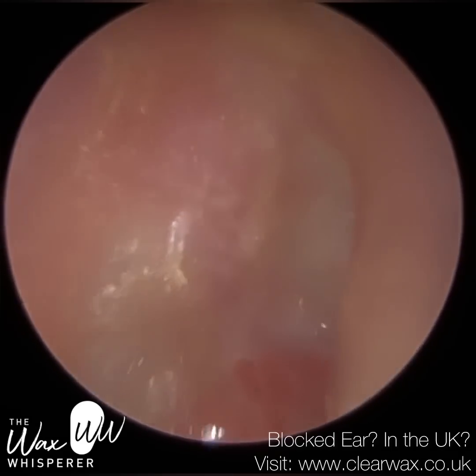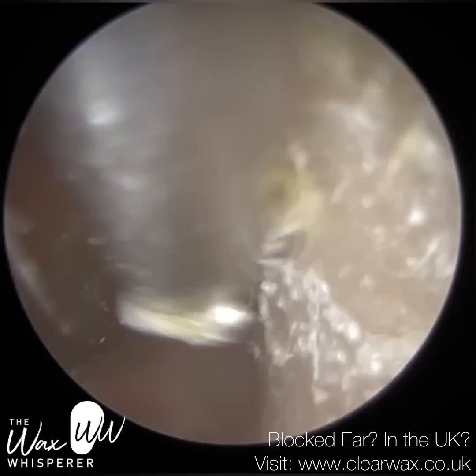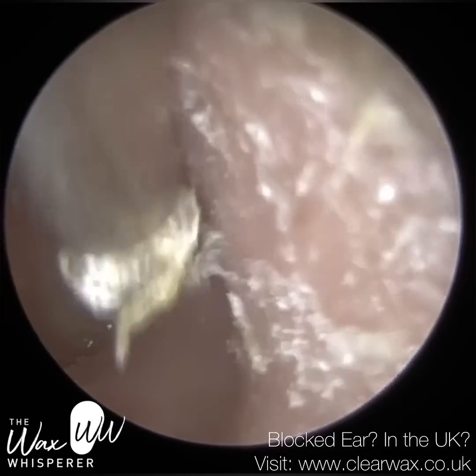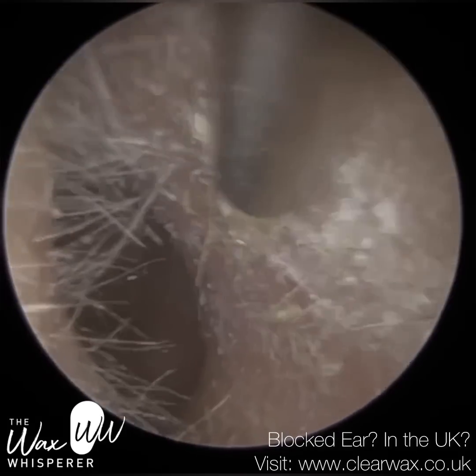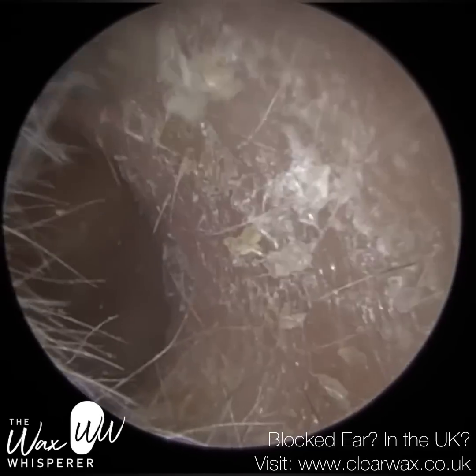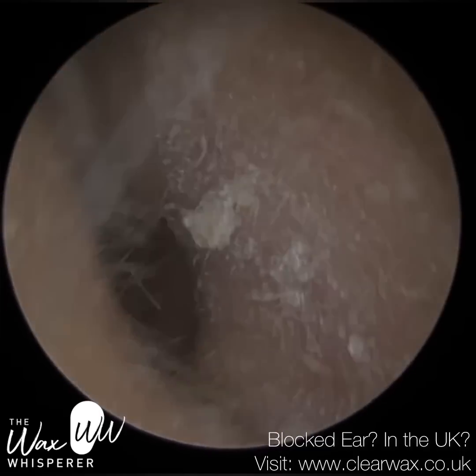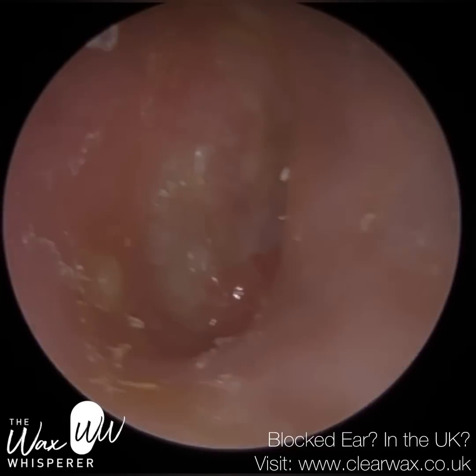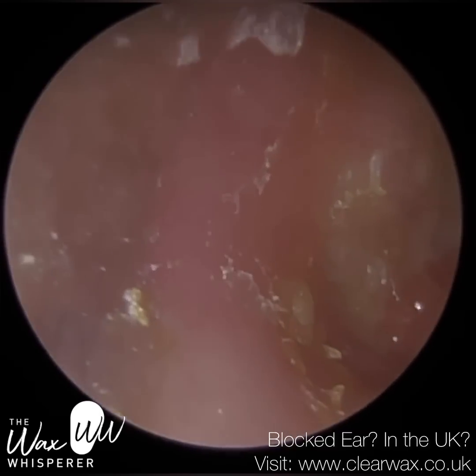I don't know about you, whenever I see granulation tissue, the hairs at the back of my neck do stand up. There's something about the appearance of it. I had a patient, I'll try and upload the video. It's a short video. In fact, it was a non-procedural video. It's a diagnostic video. It's a patient who attended with serous otitis media, so another name for middle ear effusion. So there's fluid buildup. So you can see the colour here of the skin.